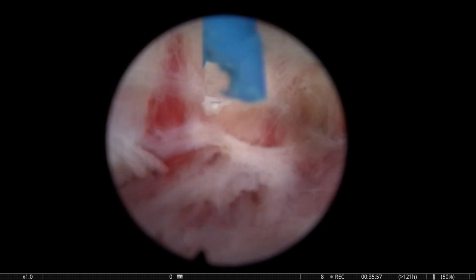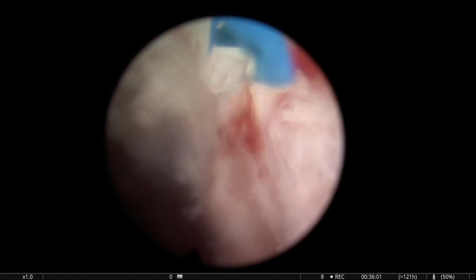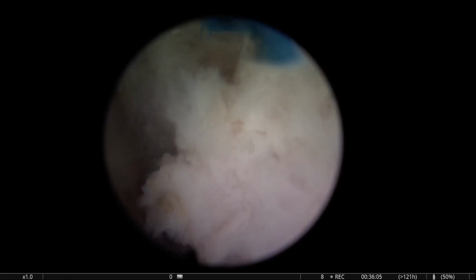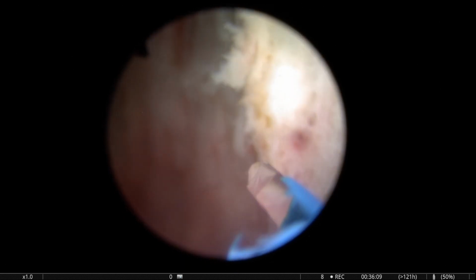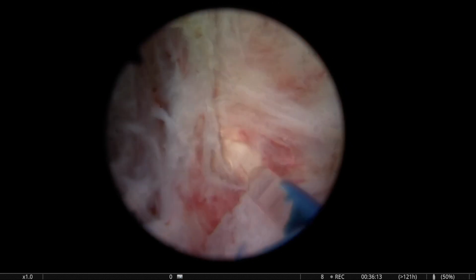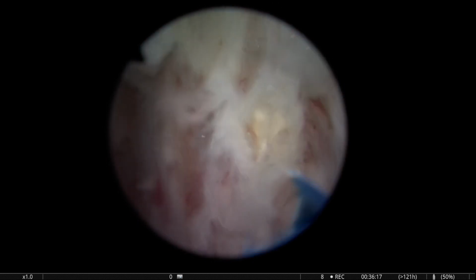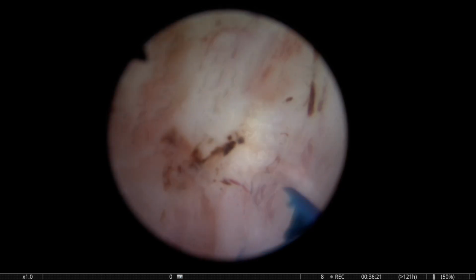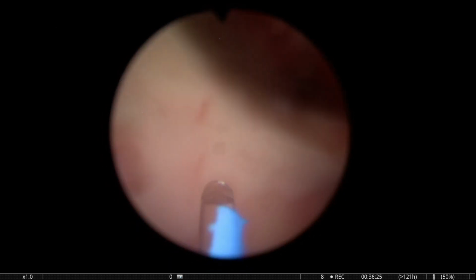But when you use high power and the capsule is very thin, I'd rather use 1 joule and probably 40 hertz, something like that, because this is a much softer effect, and it's a little bit slower, but it provides a very nice coagulation. I try to use a very long pulse or the bubble blast setting, which coagulate really well.